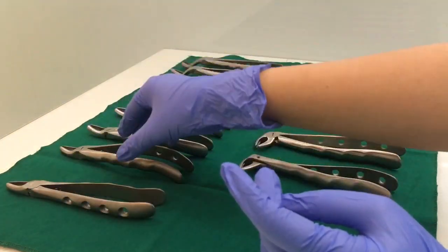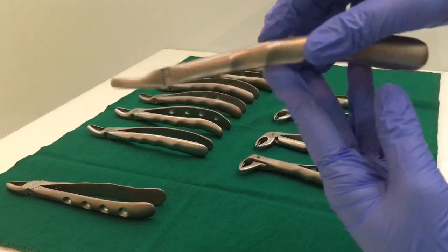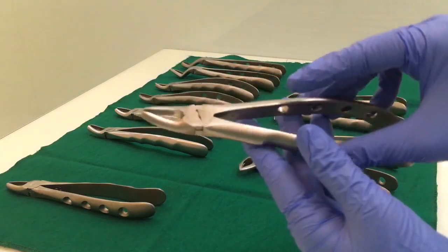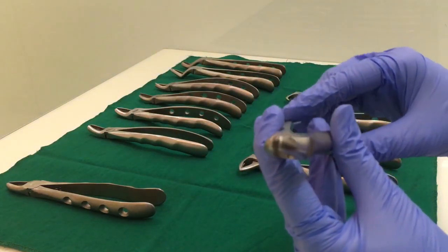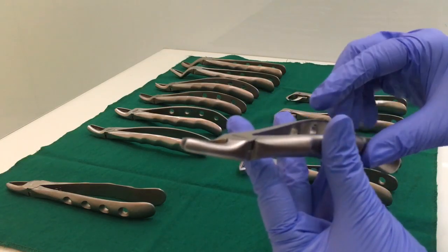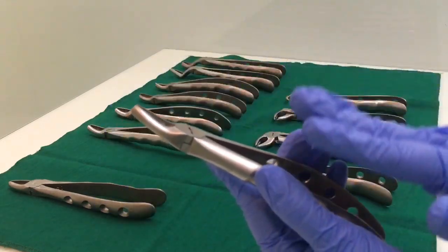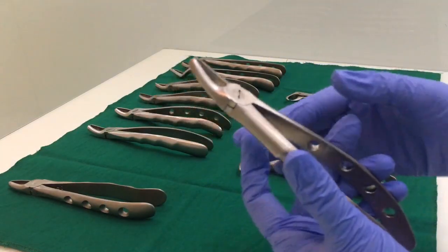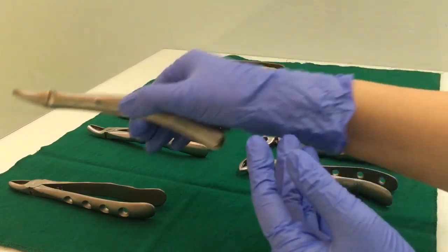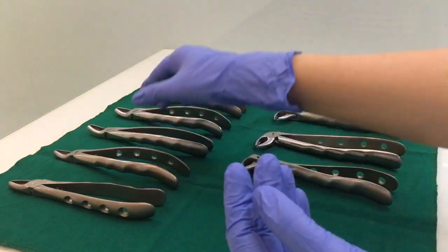The next is the upper premolar forcep. The handle is curved — it is not flat. Both beaks are rounded. Basically, the difference between the upper anterior and the upper premolar is mainly the handle, which is curved in the premolar and flat in the upper anterior forcep.